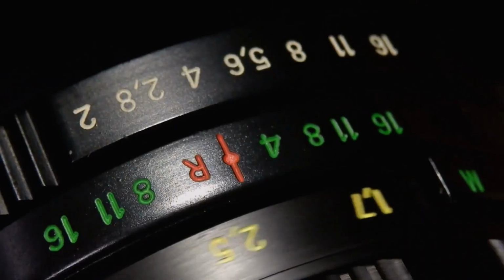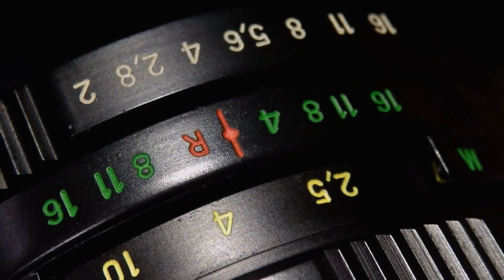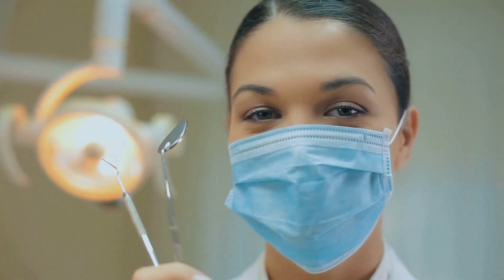Circular polarizers are generally preferred over linear polarizers, as they do not interfere with the camera's autofocus system. Secondly, the filter should be of high optical quality, minimizing any degradation of image sharpness or clarity. Look for filters that are multi-coated to reduce internal reflections and improve light transmission. The size of the filter should match the diameter of your camera lens and light source, ensuring a secure fit and preventing any light leaks.